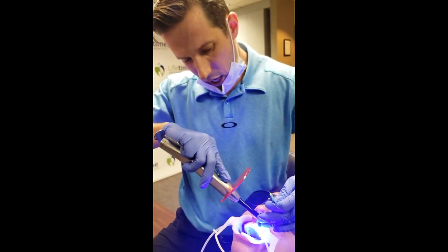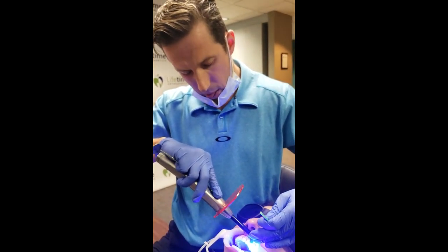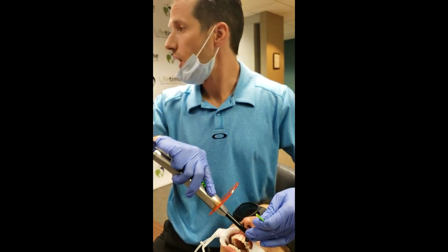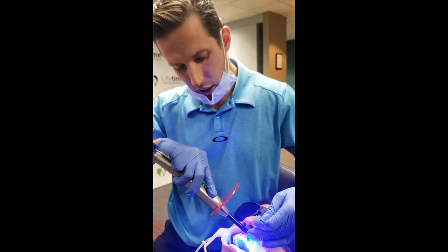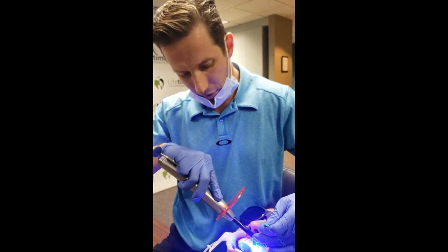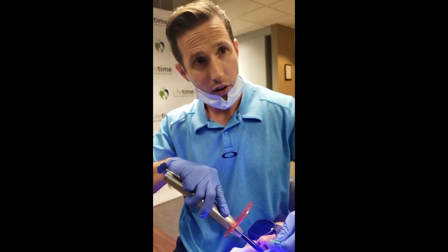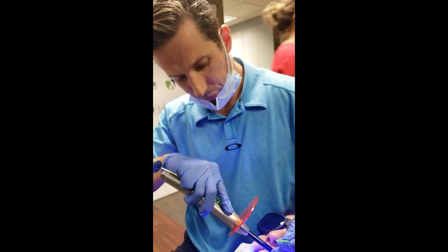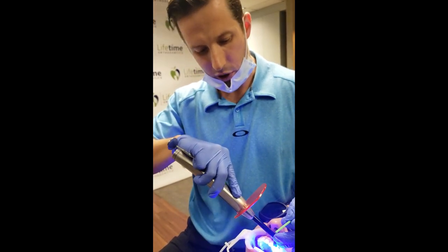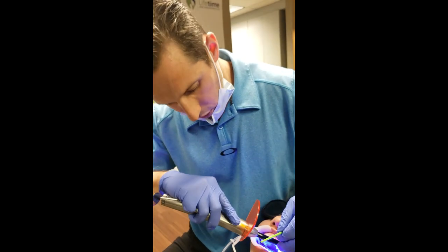I'm going to hit this one more time because I only tacked the other one. We have the motion appliance on - can you grab me the motion handout sheet so I can go over some instructions? There are usually two sizes; we always start with the force one, which are six-ounce elastics. Make sure you use the right ones for these. I'm going to hit it with a few extra beeps to be safe.